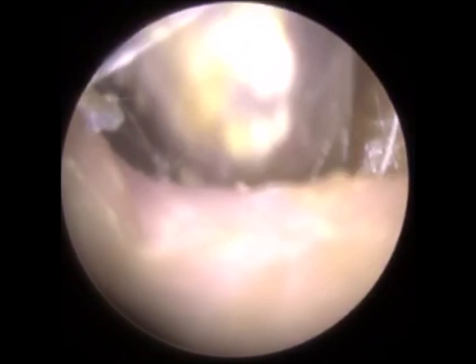Here I'm going to the roof of the ear canal, and this plug of skin, you can almost categorize it as like a piece of chewing gum stuck on a hard surface. It's dried up a bit, but it's still a bit elastic. Whenever you get an instrument like an ear hook through this plug of dead skin, there's a lot of elasticity. I don't know whether it's visible just by watching the video, but when you're performing the procedure, you feel the skin bouncing back.